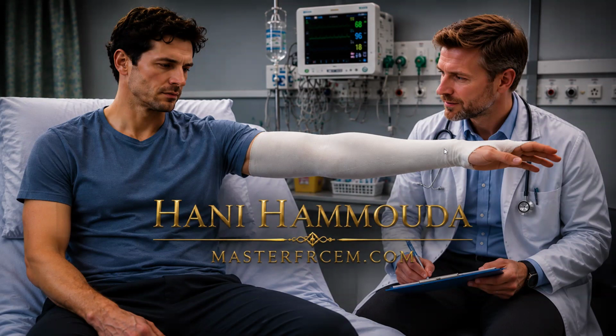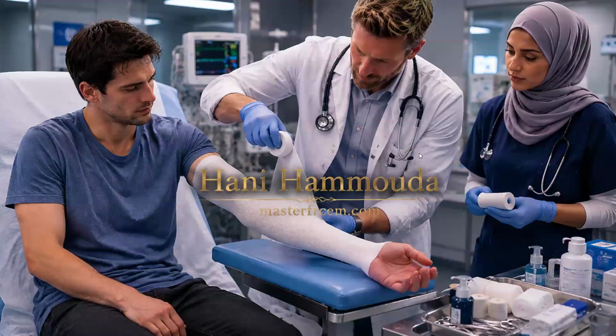So you can ask the nurse. In the exam, you will wear gloves? Yes. Mandatory? Yes. So you can take the stockinette. You can measure the stockinette from here up to 5 centimeter below the metacarpophalangeal joints and cut. Then once you cut, you can put the stockinette above the arm. Easy? Then you will go for the second step, cotton batting.